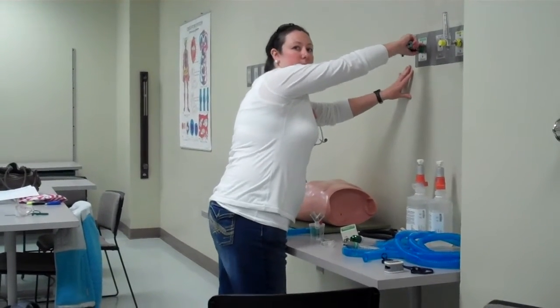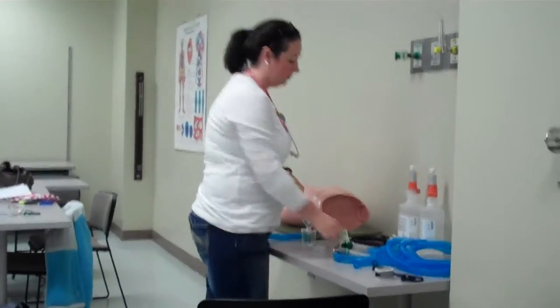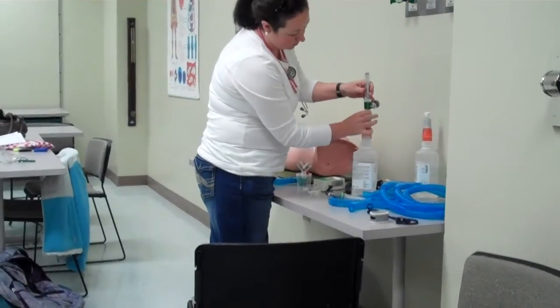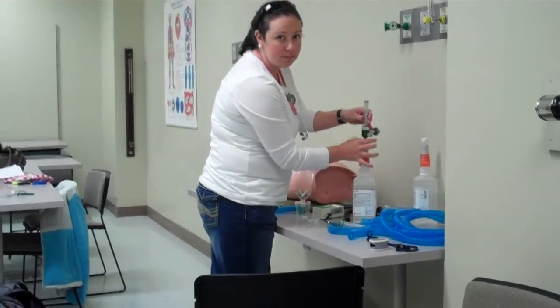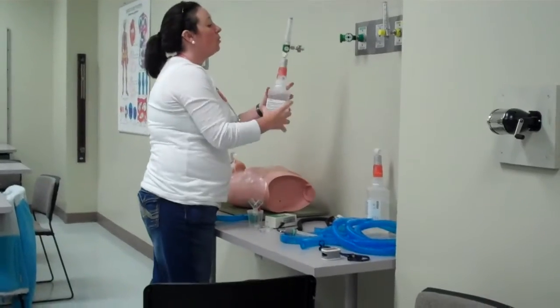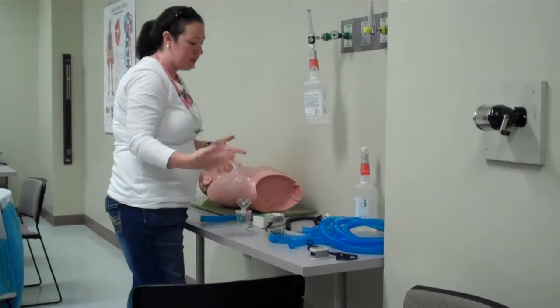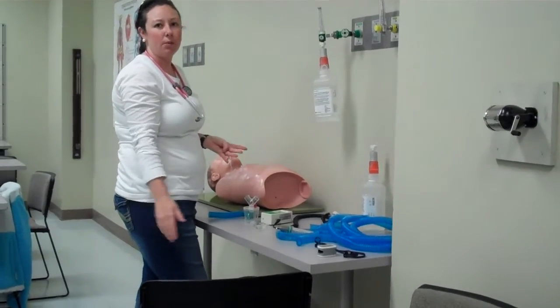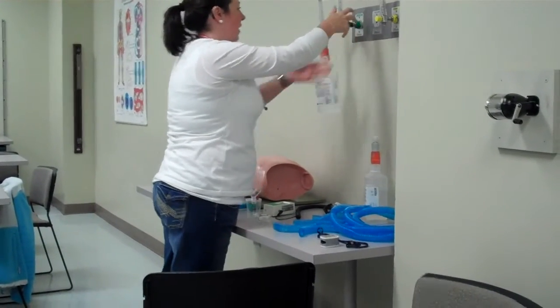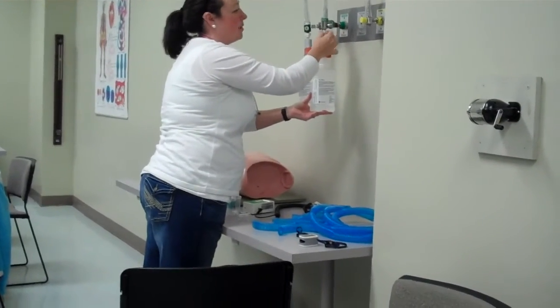So you've just explained everything, gathered all your equipment, ID'd your patient, I saw you wash your hands, you made sure the family member understood, the patient understood what you were doing, and you asked if there were any questions. What's next is I'm going to start hooking up my equipment and talk about what I'm doing. I'm going to try to make my patient feel comfortable, keep them relaxed, because being in a hospital is a stressful environment. You want to make your patients happy and do your job as correctly as possible.